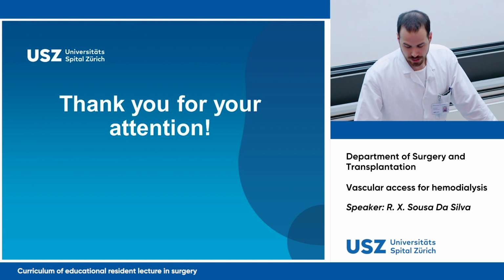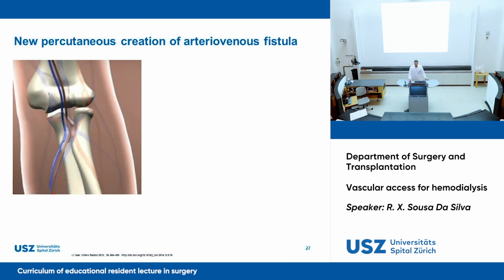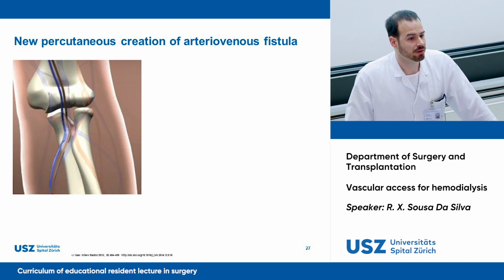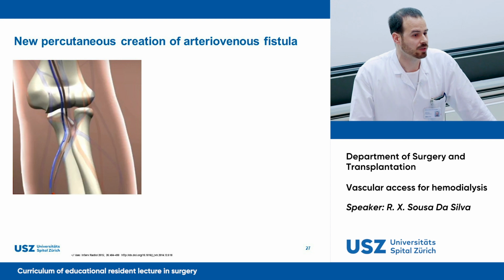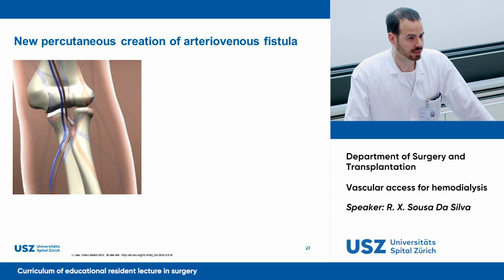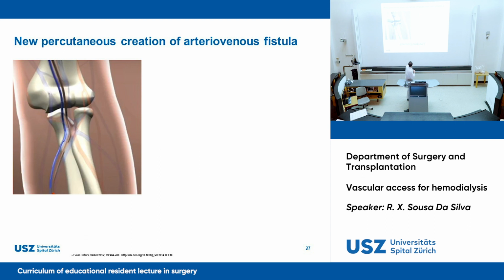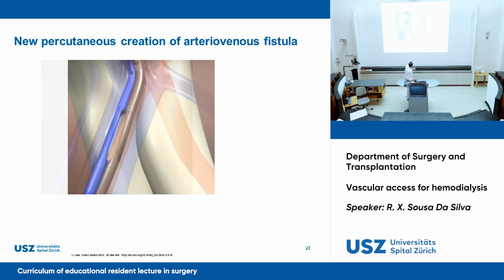Yes, I have an extra slide where I can show you. We work together with our interventional radiologist, Professor Van Matter, and he now is trying the Ellipsys system. Mostly you can use it when a primary fistula is not feasible distally because you have too small veins. So before you do a proximal surgical access, you can use this system. You go with two catheters, one in the brachial vein and one in the brachial artery. Those catheters look like this. They will turn around by themselves.